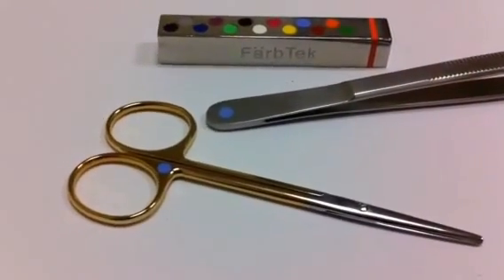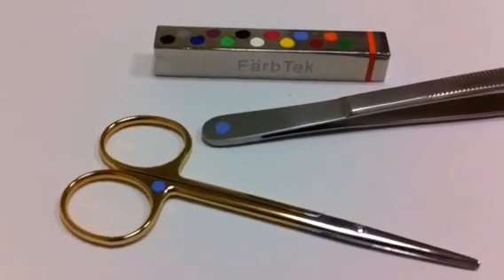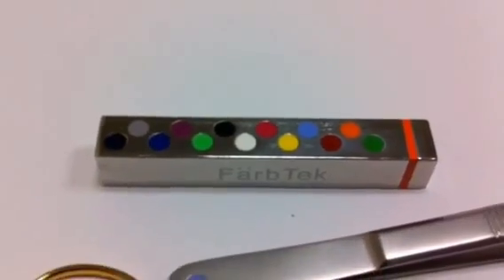Here are a couple of instruments that I have had color-coded with the FarbTech system, and here's a bar with a sample of many different colors available.